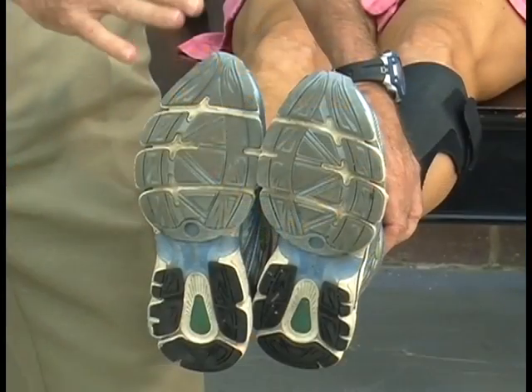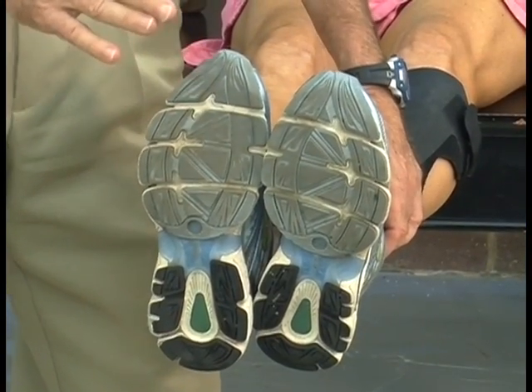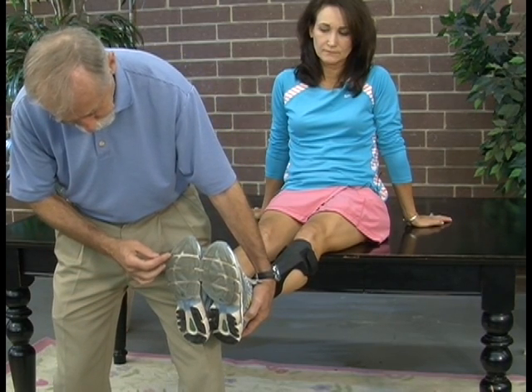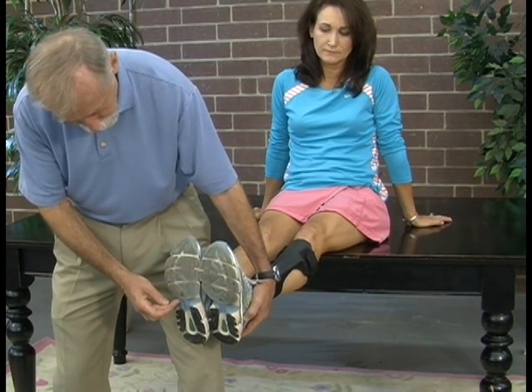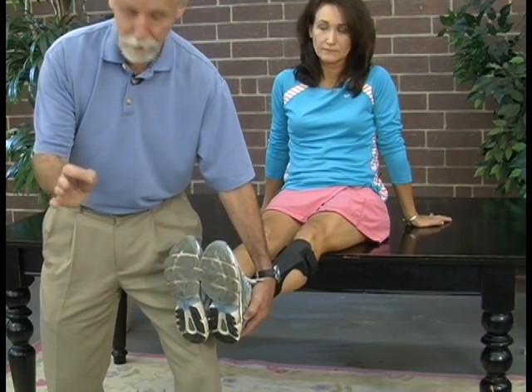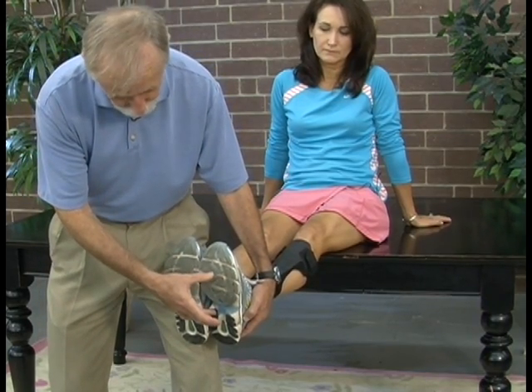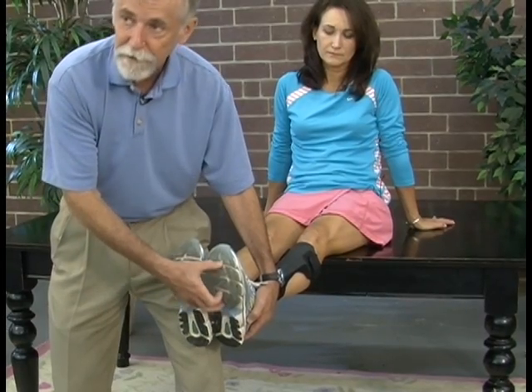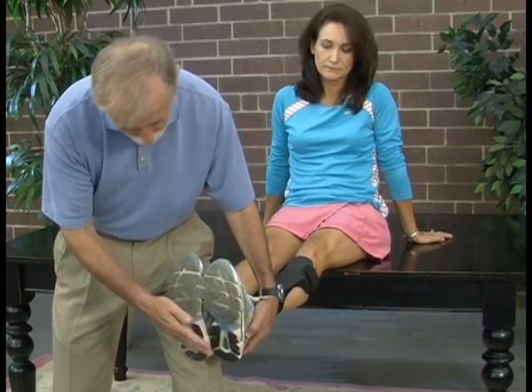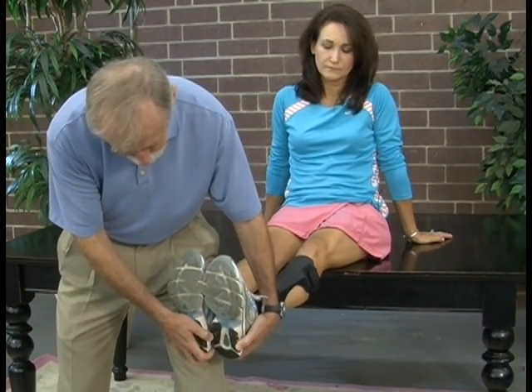Beth is what we call a forefoot striker. She actually strikes in what we call forefoot varus, or in some supination, meaning most of her strike is in the outer two-thirds of her forefoot. So she needs a flexible shoe that allows that to flex, and the orthotic has to accommodate that. She doesn't need a lot of heel buildup because she's not really a heel striker, and you don't see an abnormal wear pattern at either heel of her shoes.